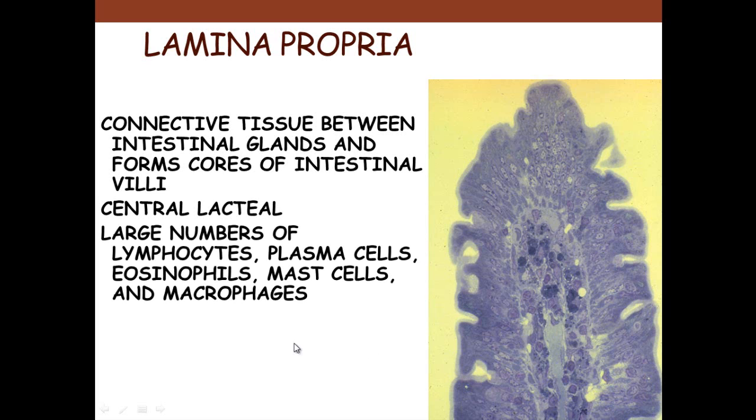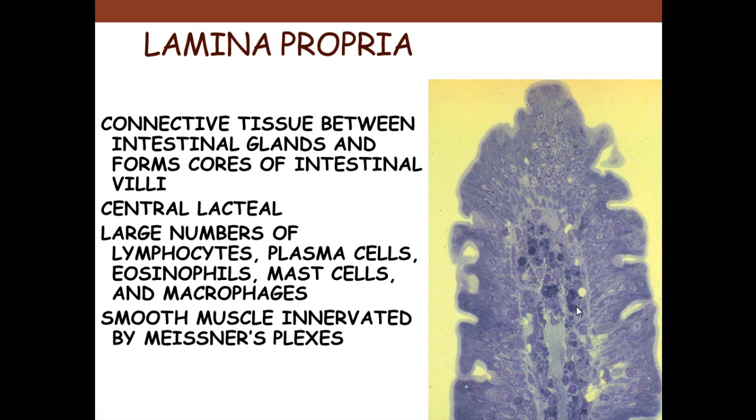We also have a host of other cells in here. We have lymphocytes in through there. We have plasma cells, which I can't see, mast cells I don't see, but you can certainly see macrophages. There's a macrophage right here. You can see the different components of degradation and phagocytosis that has occurred from these macrophages, but the other immune cells are there as well.